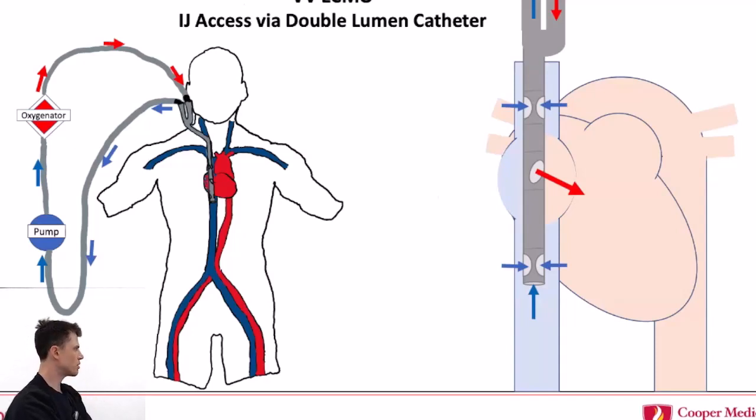We had a patient that a lot of you may remember in ECMO, who was on for COVID, who was on for 3 months with us and ended up going to Temple. She had one of these, and we had to manipulate it all the time. So do an echo, twist it around, resuture it. They're very finicky. What would you say if it's not in the proper place? What will you see clinically in the patient? You might see that their pulse ox goes down, so it's not as effectively oxygenating or ventilating them.